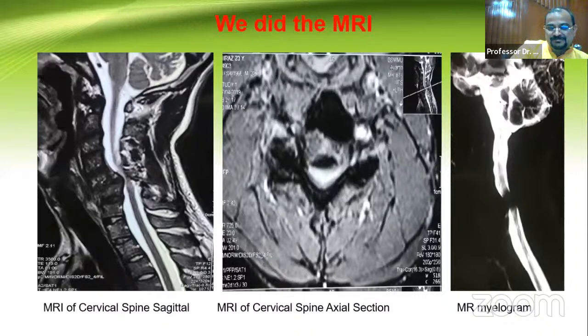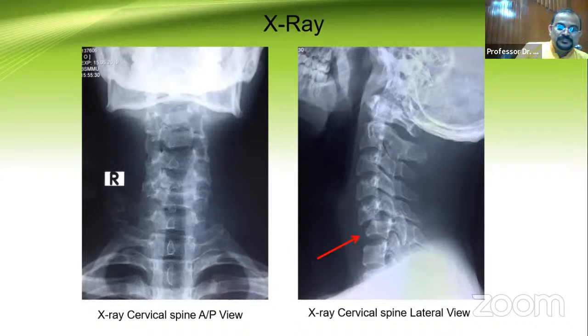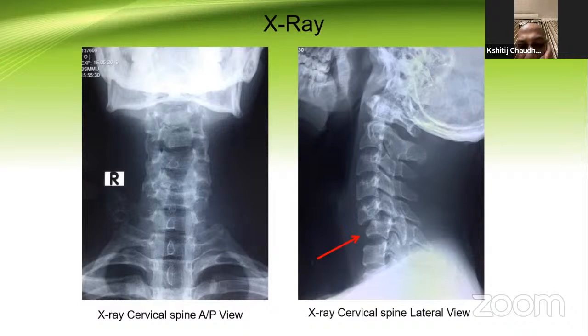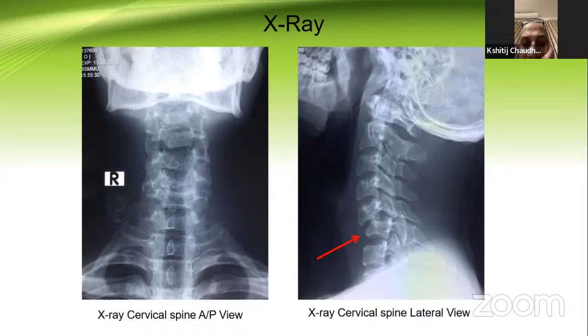I would like to take a closer look at those facet joints, how they are. Is it a facet fracture? Is it a jump facet? What kind of configuration is there at the back? Do you have any images of that on the MRI? Can you place the plain X-ray? So maybe there is not. So let's assume there is nothing there. At the lower end of this, inferior, you are seeing one piece like thing. Maybe this might be your concern actually.